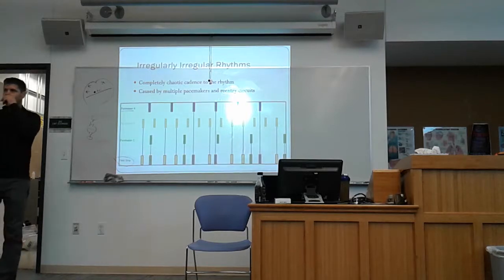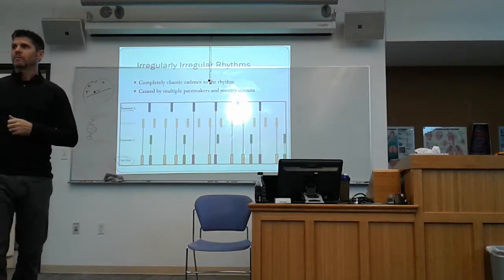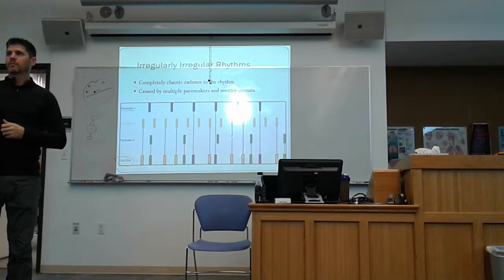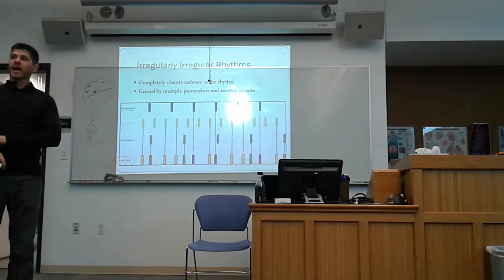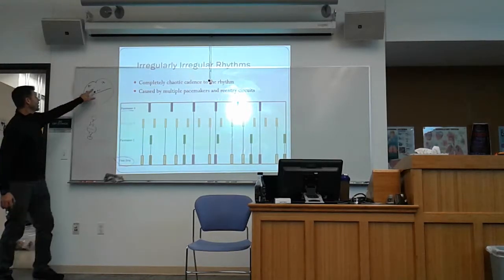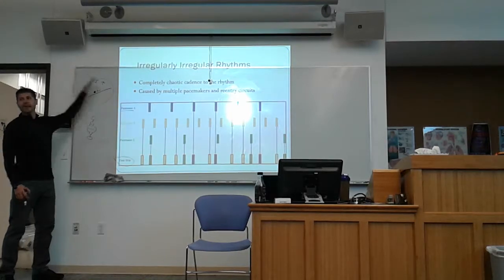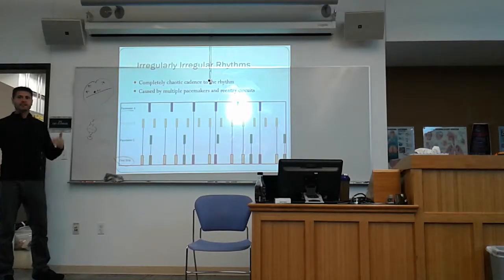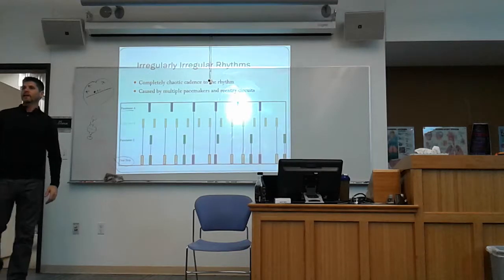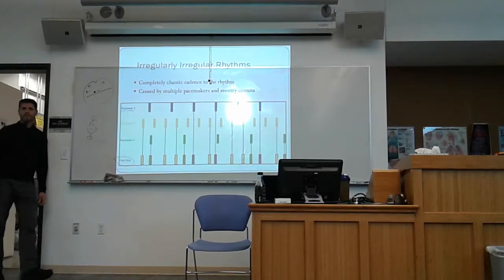Is that like a normal heart, or are you describing an irregular process? I am describing a pathologic heart. Normal would not have this or this. Normal would just have this one that sets everything, the SA node. I'm talking about something abnormal happening in the heart. And this is an example of why we see this final strip.